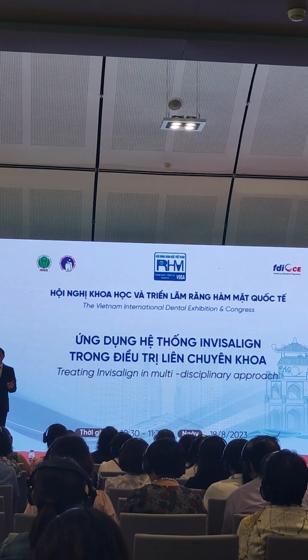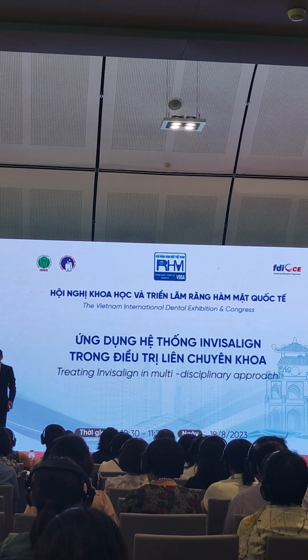Maybe we need to do it by stages. But in case one day I want to intrude the whole arch, I will probably think about attachments, because it will be more difficult when we talk about intruding the whole arch.